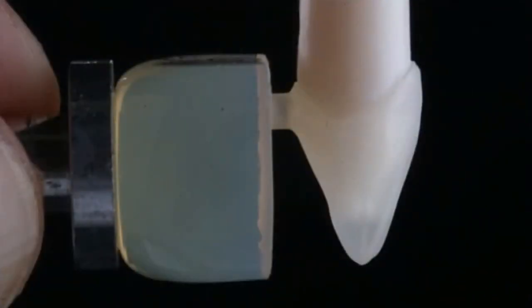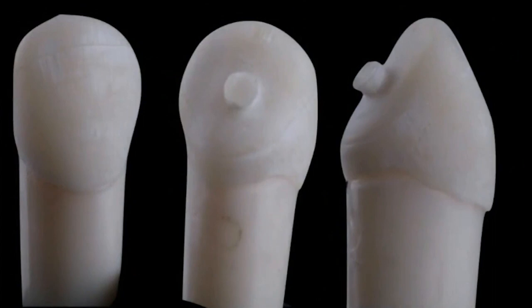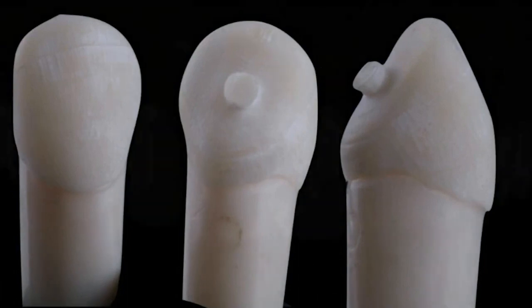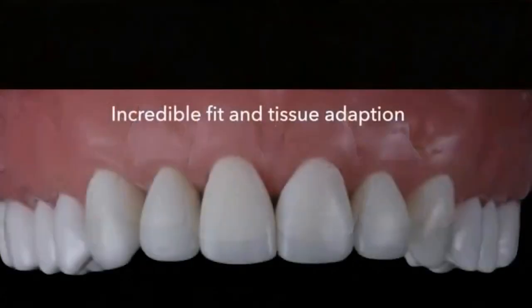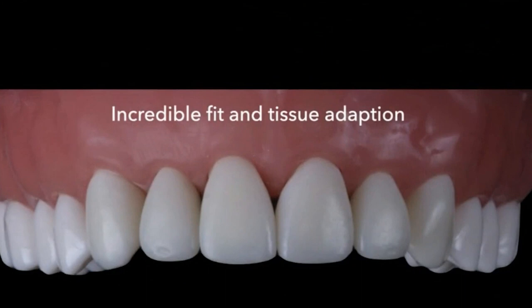Now, I was checking the fit on the dies that I printed, and look at that. The fit is beautiful on the milled restorations. But how about the printed? Same thing, no difference. The integrity of the margin is there. It's beautiful. It prints really nice. Okay? We polished all the printed restorations, and all we're going to do is push them all the way into the soft tissue, and look at the adaptation that we have on the soft tissue. It's just incredible. So I'm looking forward to always having beautiful, nice soft tissue.